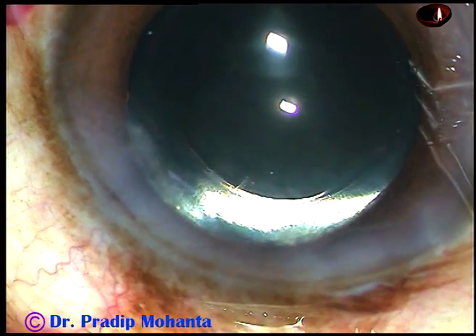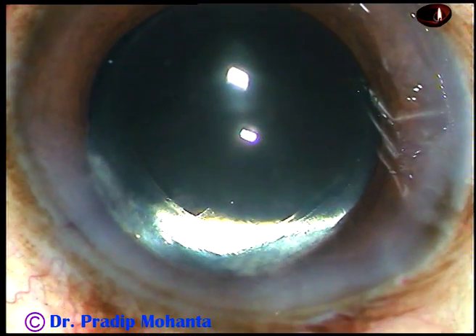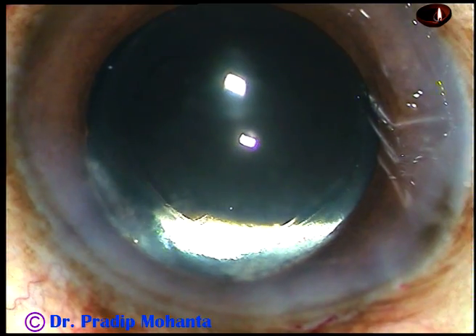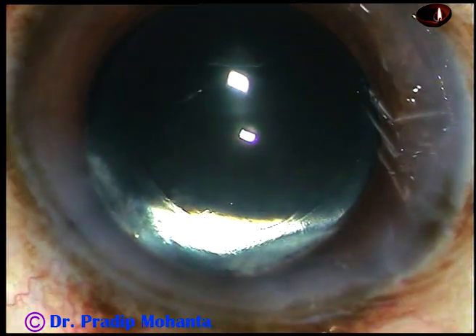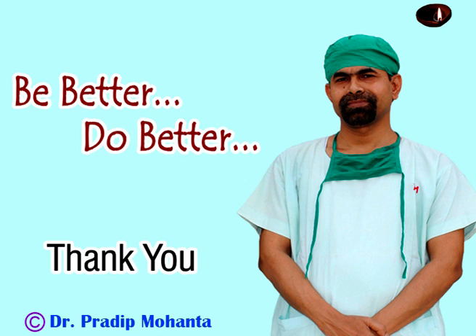We must check the wounds. There should not be any leakage from any side. You should check the intraocular pressure digitally and then conclude the case. Thank you very much for your attention. Hope this video will help you in developing your surgical skills. Be a great surgeon — serve mankind with empathy, respect, and great surgical skills.